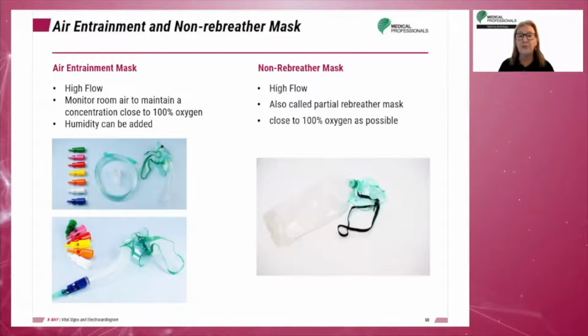The non-rebreather is not well tolerated by patients. It is hot, sticks to the skin, muffles the speech, and must be removed for eating.